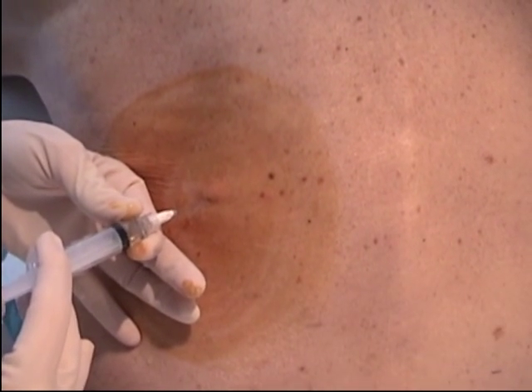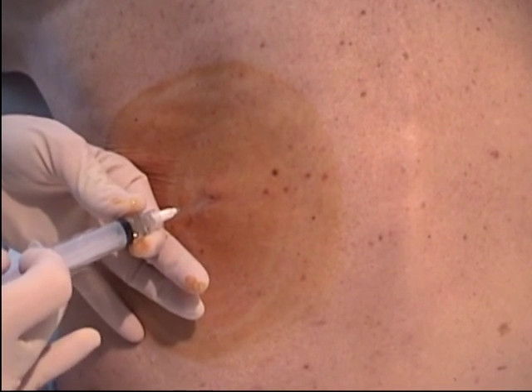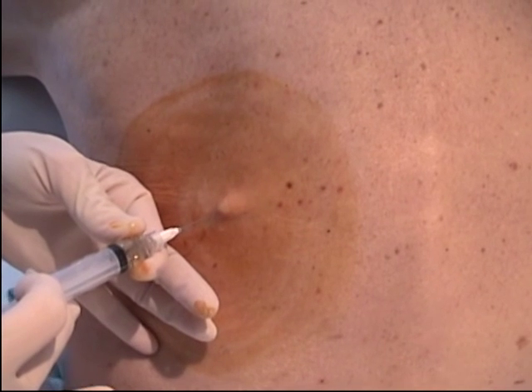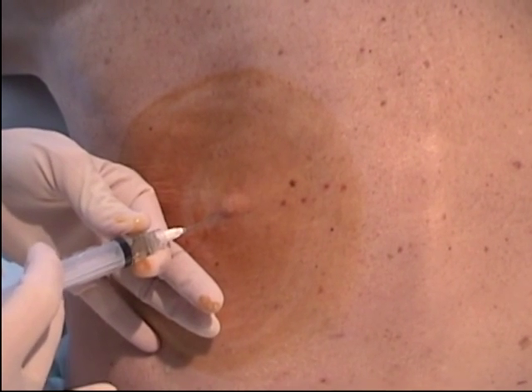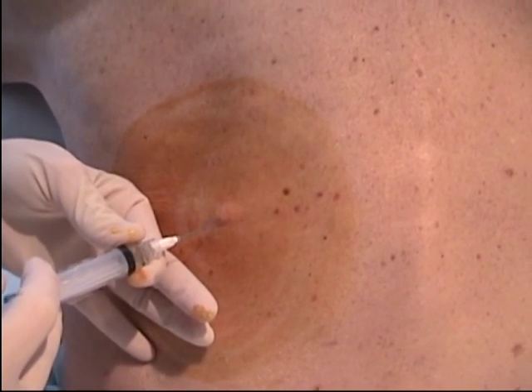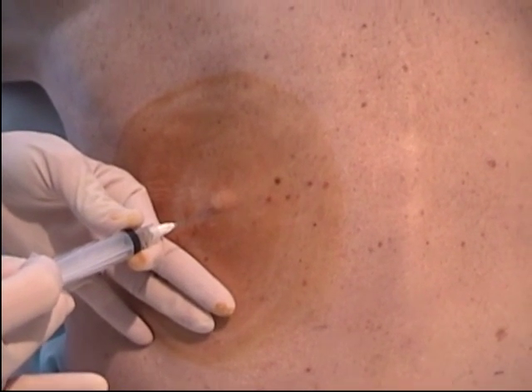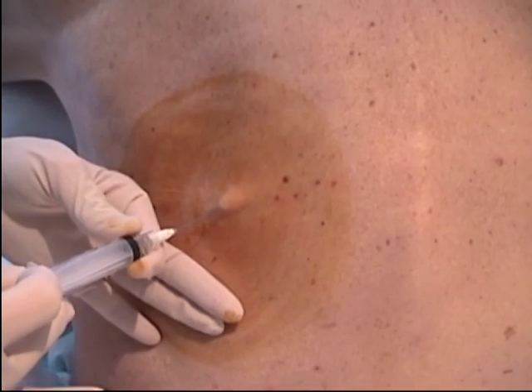You can usually feel a palpable pop when penetrating the tough, fibrous pleura. Inject 2 cc's of anesthetic into the pleural space, and then withdraw the needle only slightly to infuse 1 more cc of anesthetic at the pleura. This technique provides superb anesthesia.